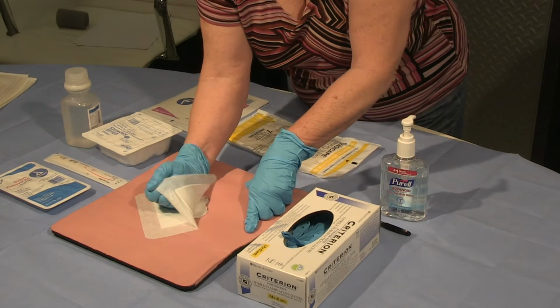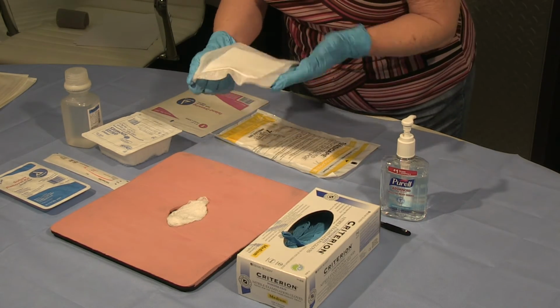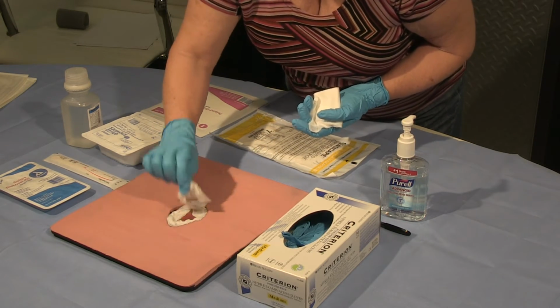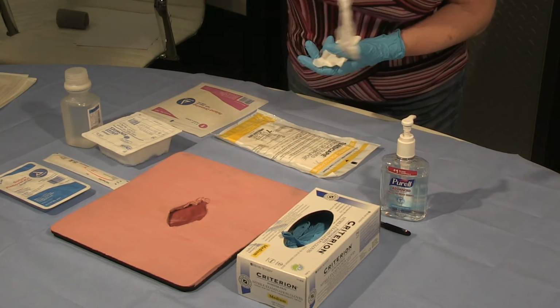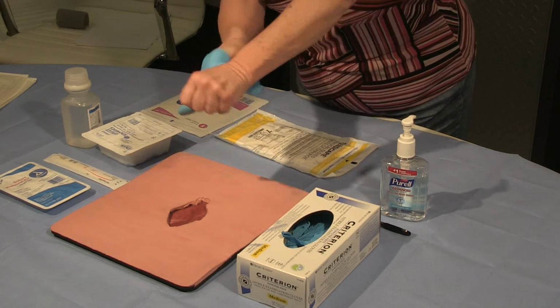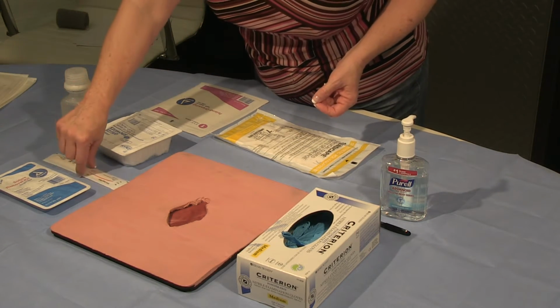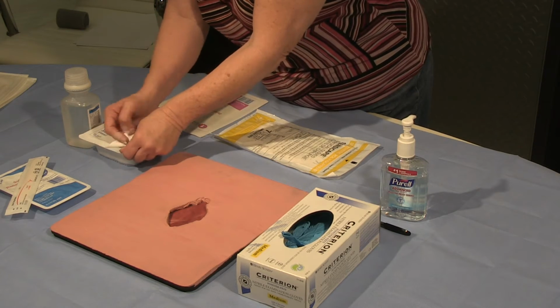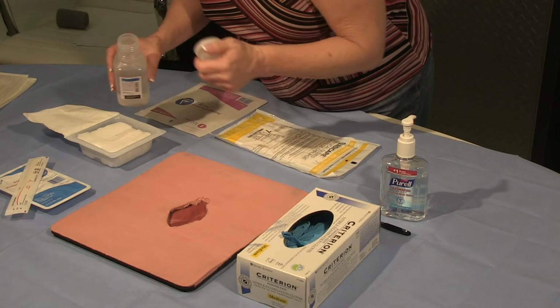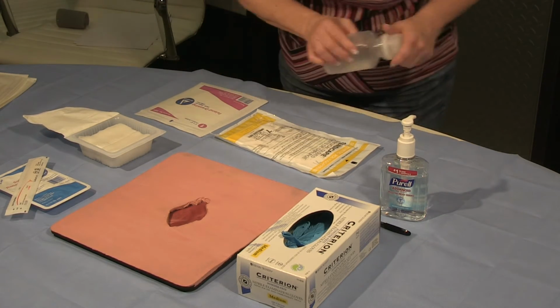After washing hands, the medical assistant with clean gloves removes the old dressing and examines it for foul odor or unexpected discharge. In the absence of odor or discharge to the dressing or wound, the medical assistant disposes of the dressing using the soiled gloves that he or she is now wearing. With clean, bare hands, the medical assistant opens the sterile packages for the supplies to be used in the wet to dry dressing change. These include sterile water, a 4x4 boat, and a 4x6 dry dressing. The sterile water is poured into the 4x4 boat.